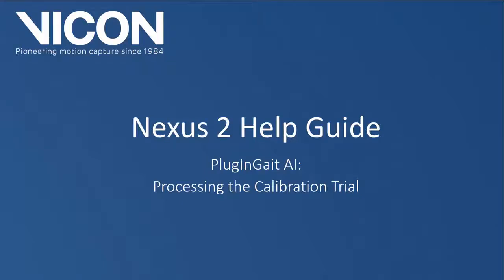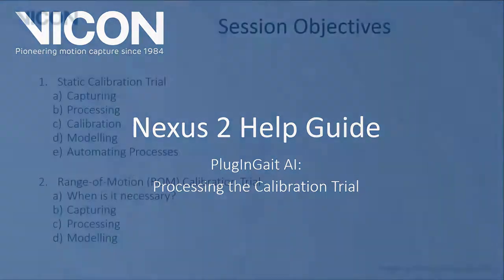Welcome to the Nexus 2 help guide. This session covers capturing, calibrating, and processing a calibration trial when using the plug-in-gait labeling template and biomechanical model.